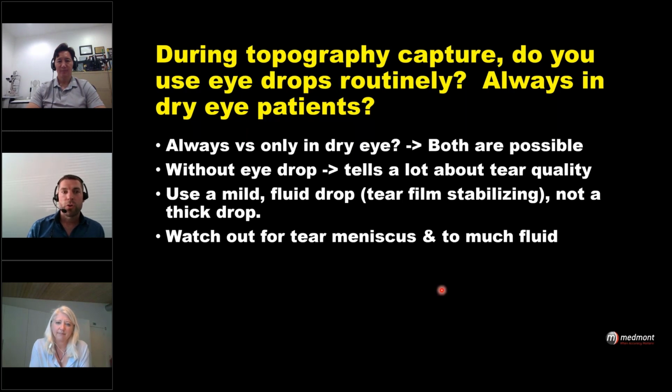In case of scarring or very hard to capture eyes, we often use a daily disposable lens, low power, as you mentioned during one of the sessions, and this is also something we do.